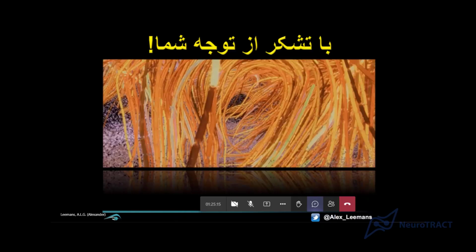And what I will show with the pre-processing, for instance, can take maybe even an hour or something like that, depending on data size and things. But if you do something like that, you would probably do it on maybe 10 subjects or even more, and then you can run it overnight or over the weekend, right? So it's all about being clever about when to process, how to process, and why to process stuff.